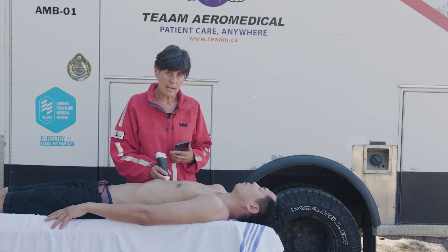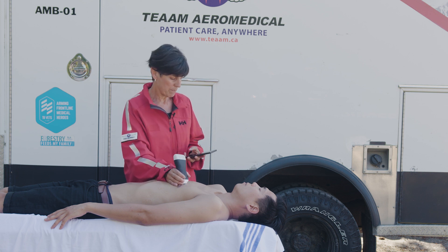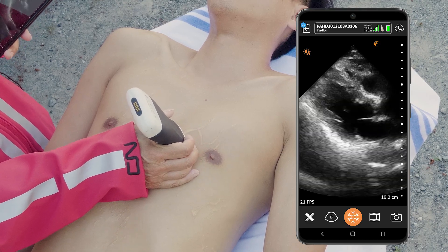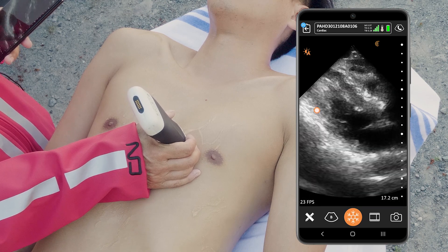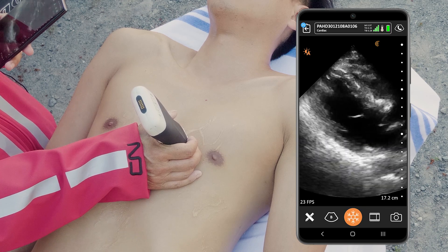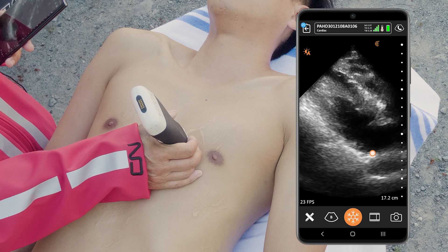I'm going to start the exam in the parasternal window. There are a number of views that we're going to do with this exam. From the parasternal long axis I'm going to look at the left ventricle, and from here I'll be able to assess that the septal and posterior left ventricular walls are contracting well and that the mitral valve is opening well.